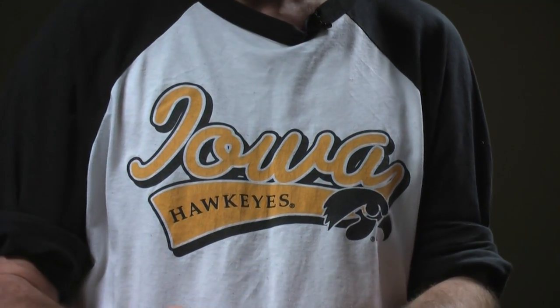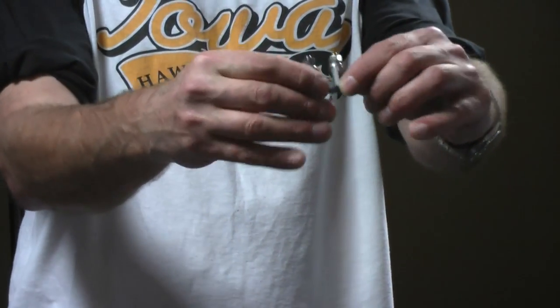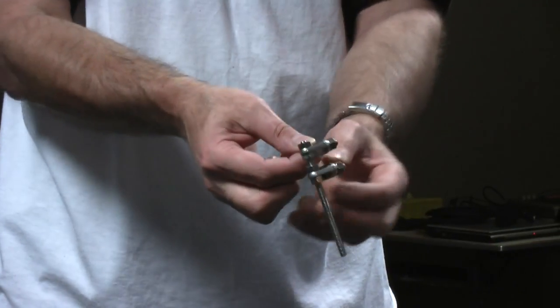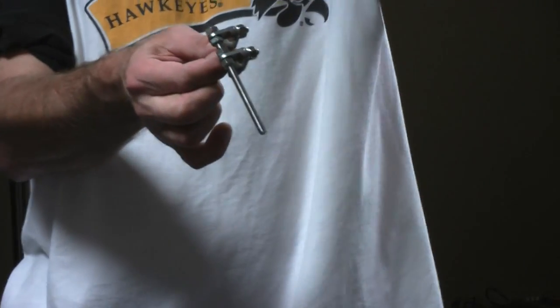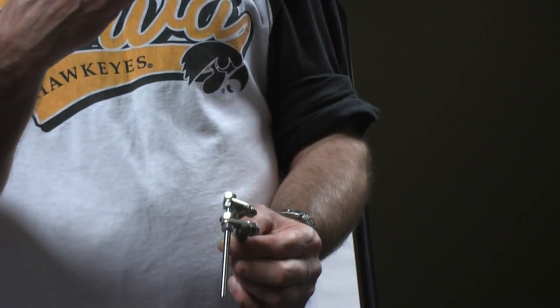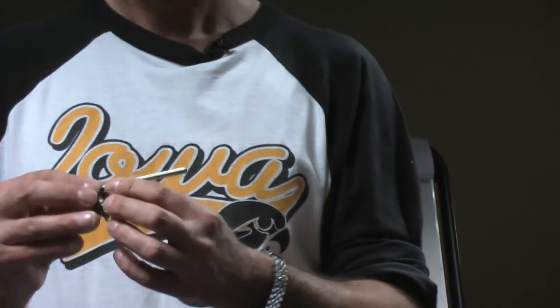What is that motor? Is it hinge as well? It is. I'll show you exactly what it is. Threaded rod, same size, which then has on it, bolted onto it 2 high-profile males, and onto the end of each high-profile male is a high-profile 90-90. Okay, and when we get round to fastening it on, the flat side of the 90-90s is what's going to fasten onto the ring. Okay. So the correcting rod hangs off outside the ring. Okay, you can do it perfectly well with an extra one of those. There is no reason you can't do it like that. I think it just has a small number of advantages. Okay, so there we go.